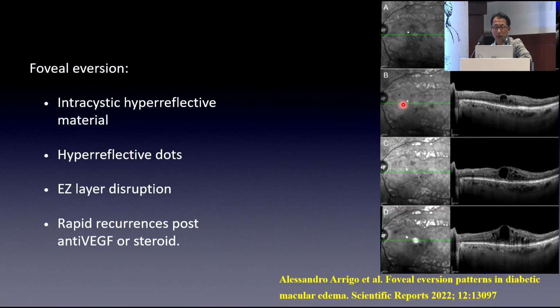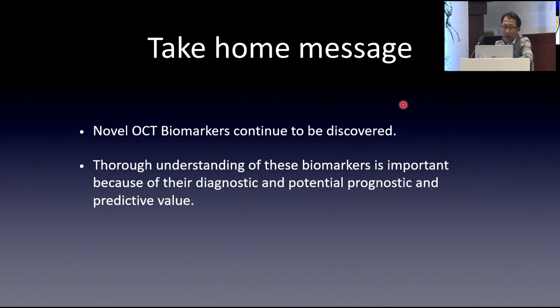So actually, the take-home message is that a thorough understanding of these biomarkers is important because of their diagnostic and potential prognostic and predictive value.